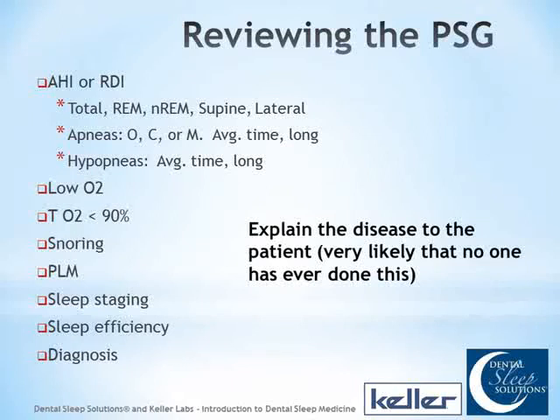But I think making sure you have that in your hand if they've had a sleep study prior to the consultation is imperative. It's kind of a waste of time if you don't know what you're dealing with. Someone who has an AHI of 90 versus someone who has an AHI of 6, part of whether they're a good candidate for treatment is their diagnosis. So having this in hand, reviewing it, pulling out this pertinent information you can see on the screen prior to them coming to your appointment, making sure that you got a feel for what the level of apnea is for that patient prior to even walking into the room for the consult is important.